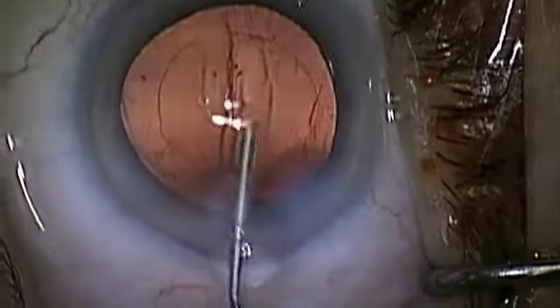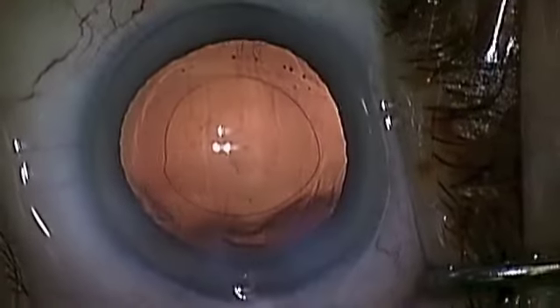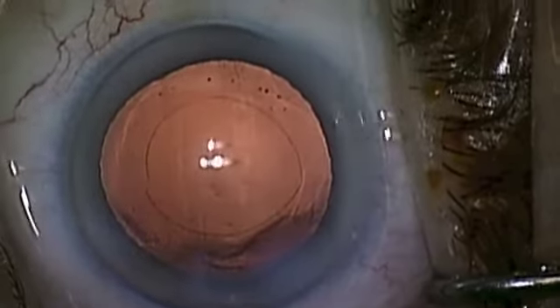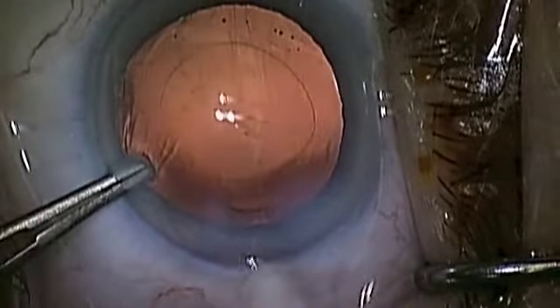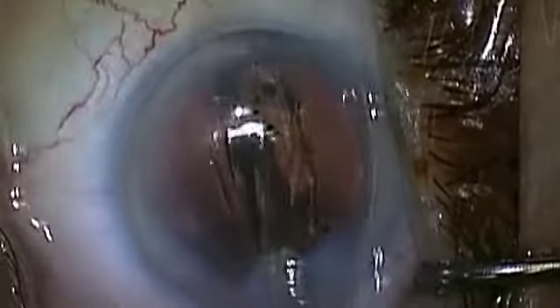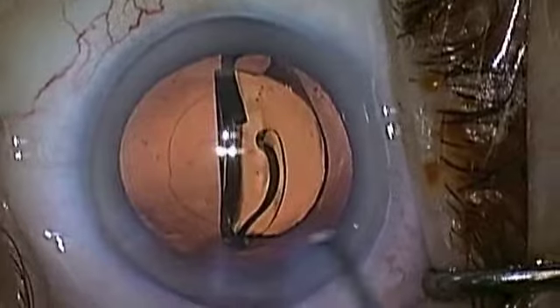And now let me show you why it's so important to have a very good circular anterior capsular opening. This is the space into which your new implant goes that replaces your cataract. In this video, you can see me inserting a new intraocular lens into this eye, and it's going to go into the capsular bag through the 5 millimeter circular opening. The accuracy of that 5 millimeter circular opening helps us know that the postoperative refraction, or what the patient will see without glasses, is going to be consistent and reproducible.